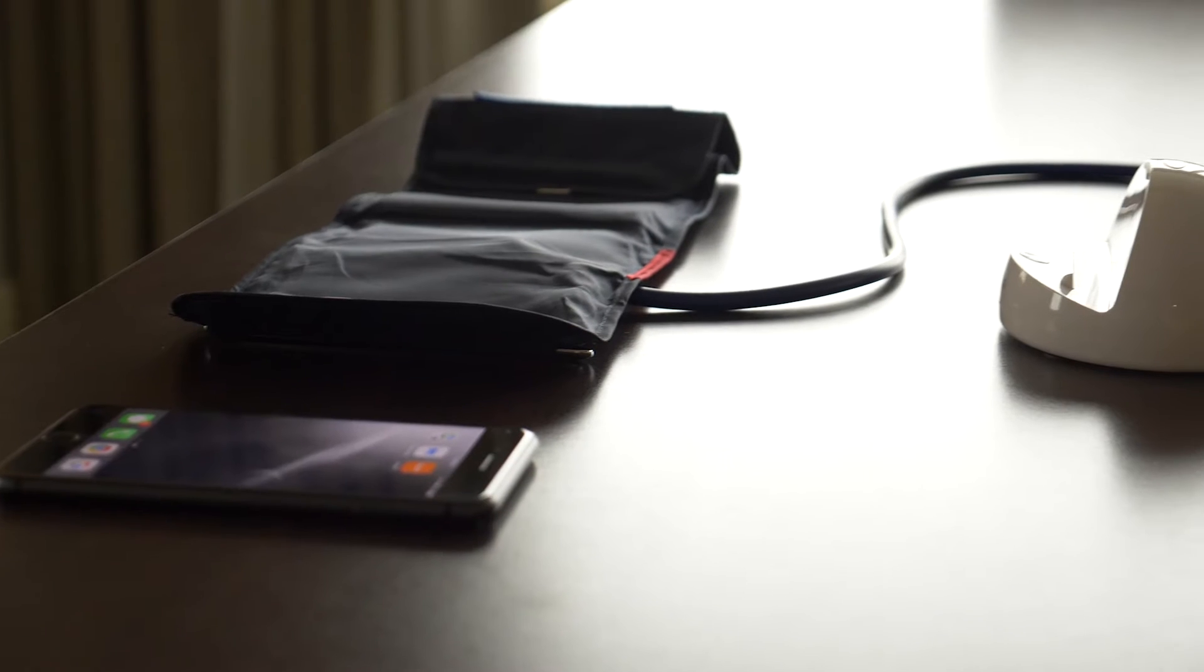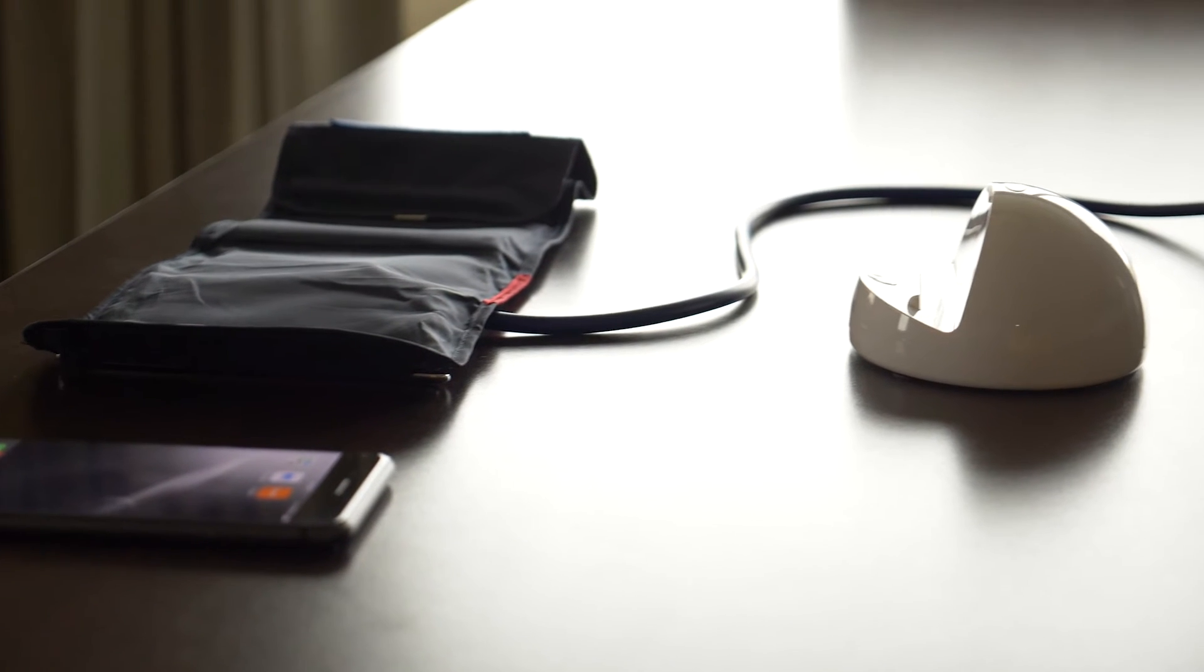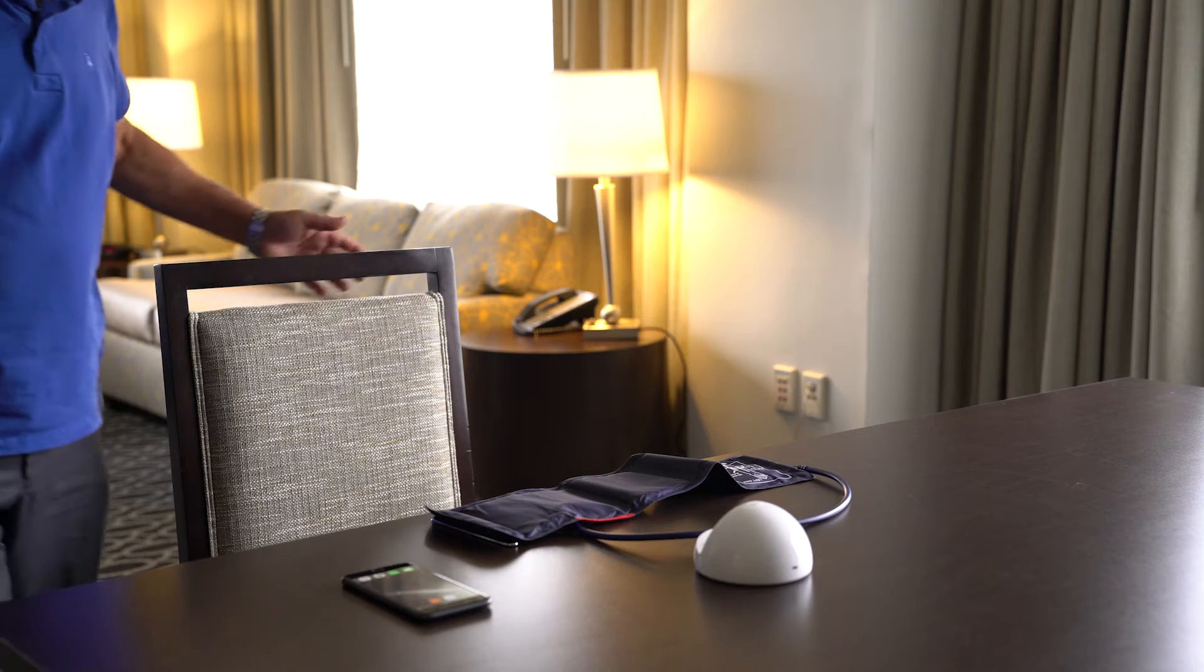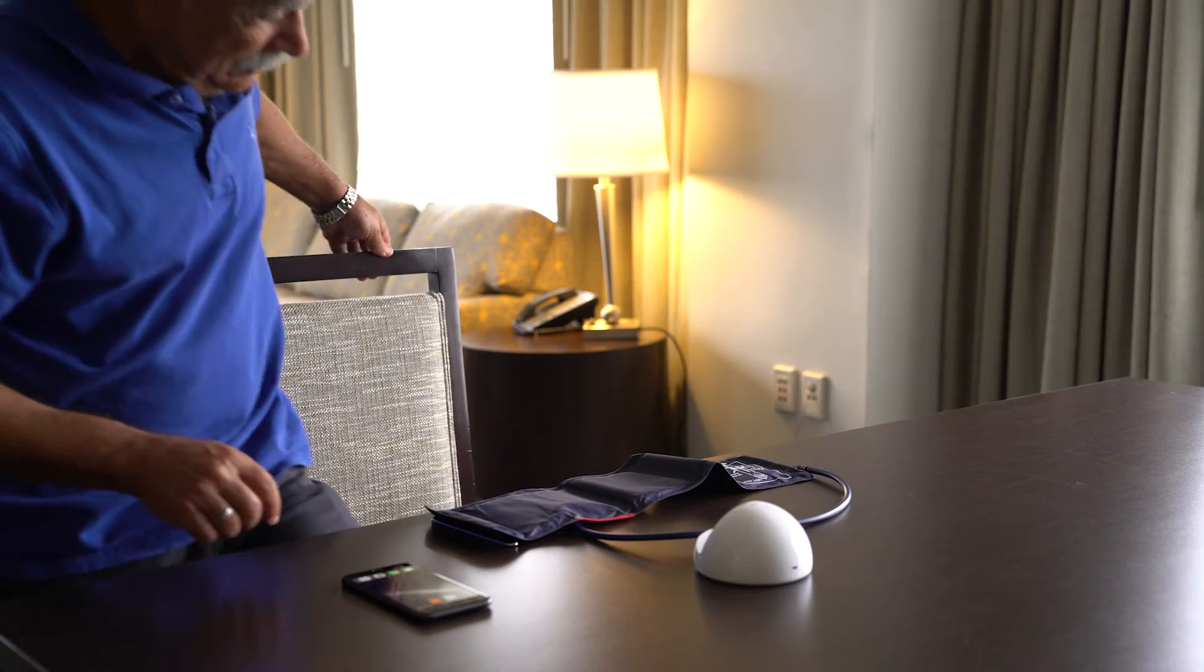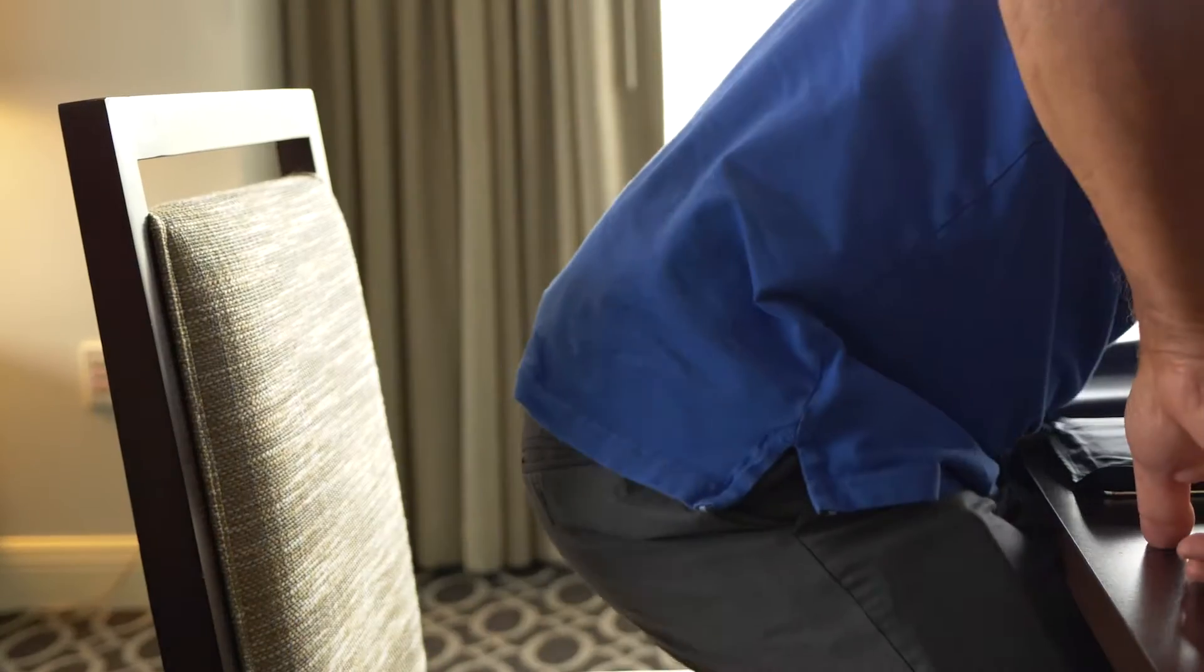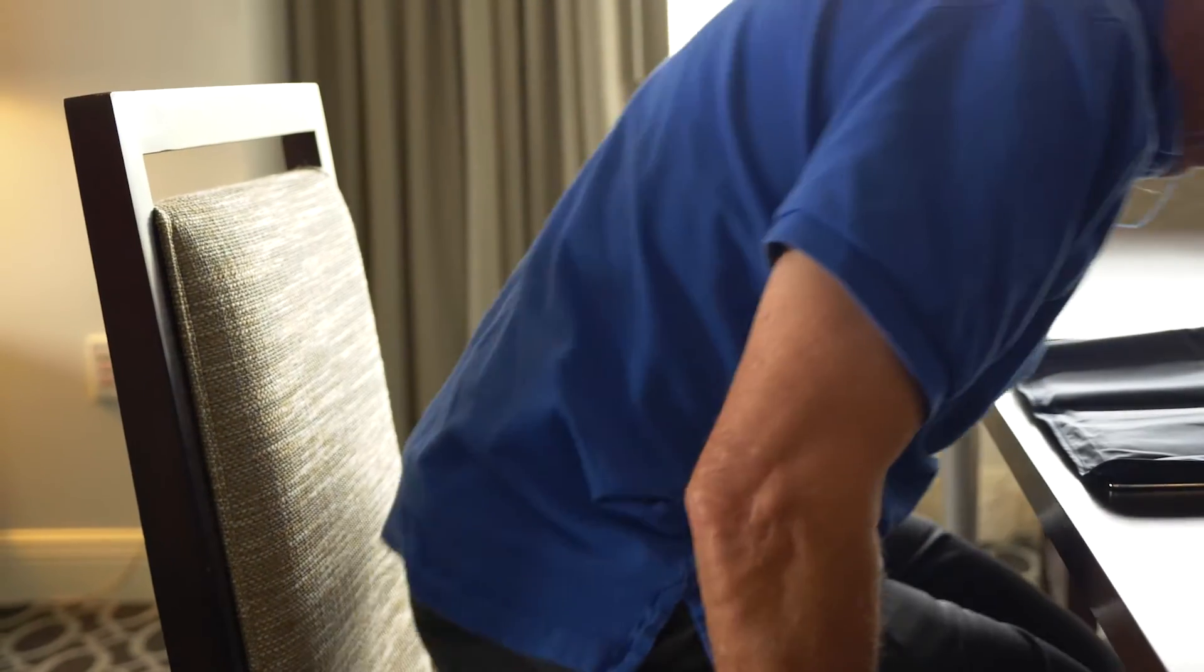Before getting started, you'll also want to empty your bladder. Next, gather your digital blood pressure cuff and smartphone and find a comfortable place to sit with good back support at a table or desk.